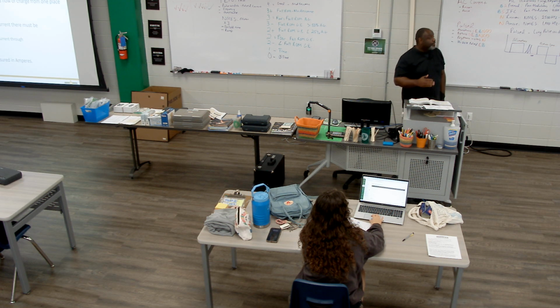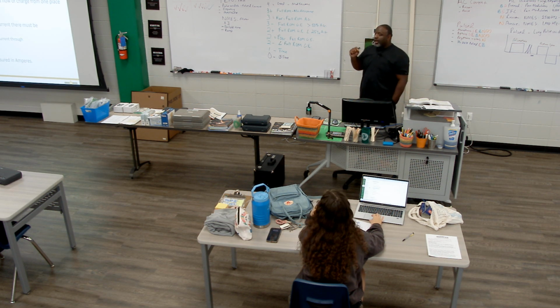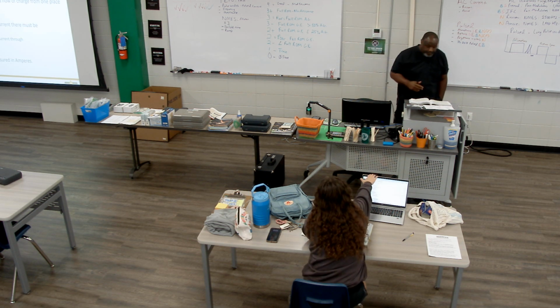So this will be the first time in all of our lecturing we're going to actually deal with something that is a direct current. Everything else we've dealt with was either AC or pulse current. This is going to be true DC current. So Ionto is true DC current.